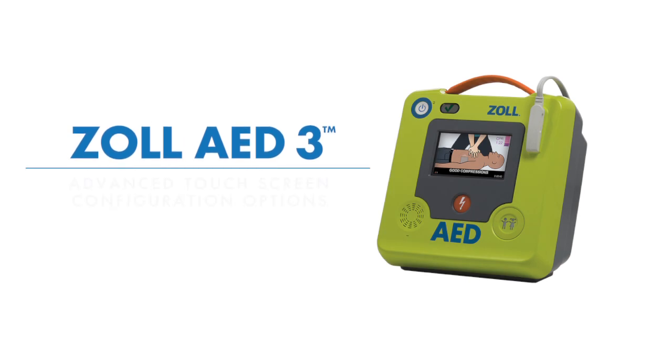The Zoll AED 3 includes advanced configuration options that enable you to quickly and easily configure your AED. This can be done directly on the device using the AED 3's full-color interactive touchscreen display. In this module, we will familiarize you with the advanced configuration options available on the Zoll AED 3.